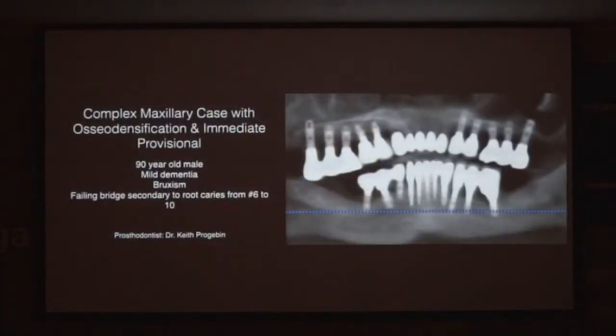So you were asking me before about artifact. Look at this patient. You think there's going to be some artifact on that CT? Okay, this is a gentleman. He's 90 years old. He's got a mild dementia, so removable is no good for him. Obviously, he doesn't have a problem with money. I didn't put all those implants in. One of my colleagues did.